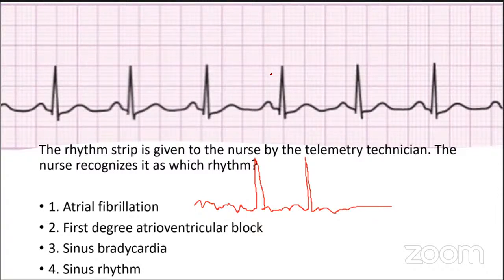Another way you can do this is to check the rate. And please, when you are reading, try to stick to one technique. If, for example, you have mastered the art of using 300, 150, 100, 75, 60, 50, then stick with it. There's no need mastering all of the different techniques.